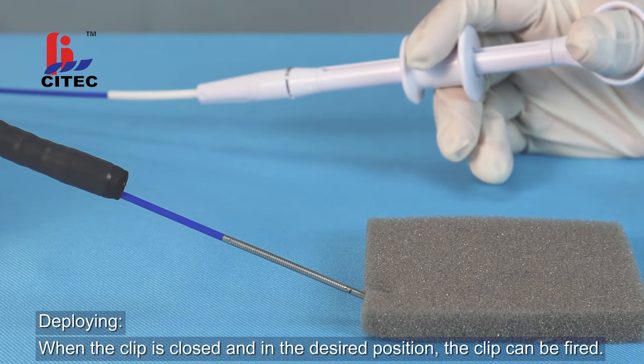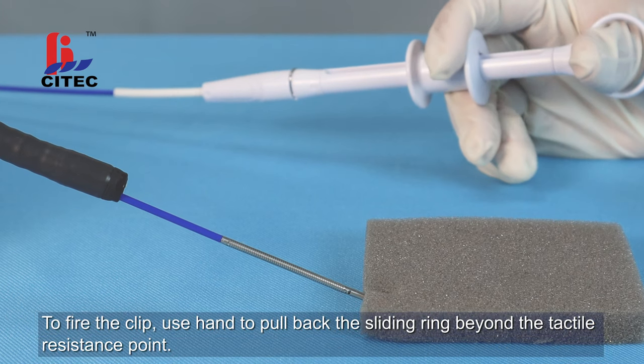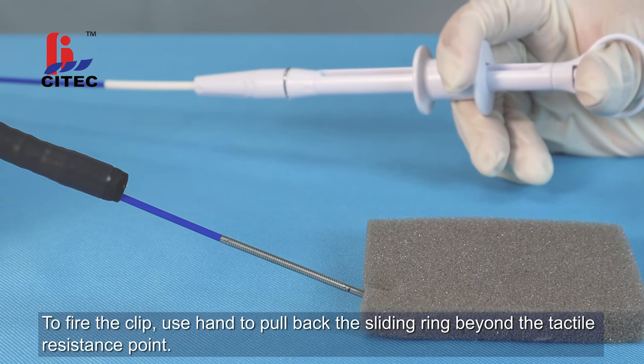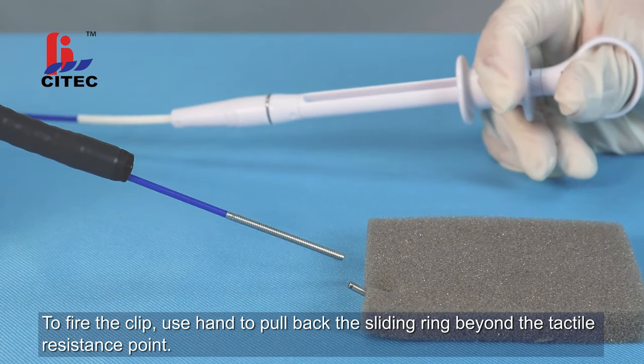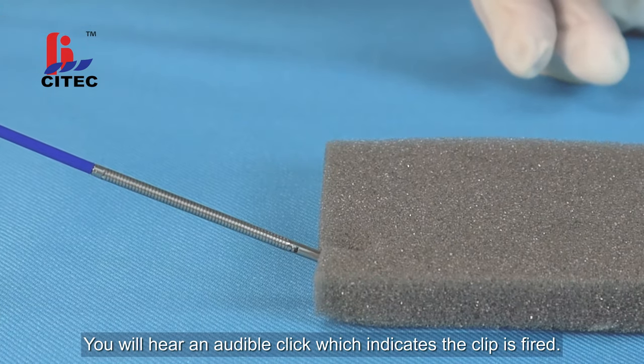When the clip is closed and in the desired position, the clip can be fired. To fire the clip, use a hand to pull back the sliding ring beyond the tactile resistance point. You will hear an audible click, which indicates the clip is fired.